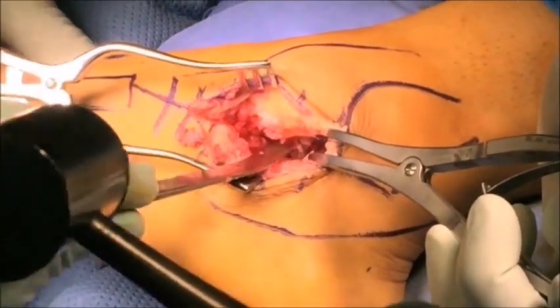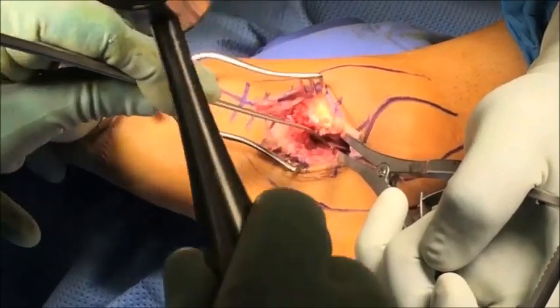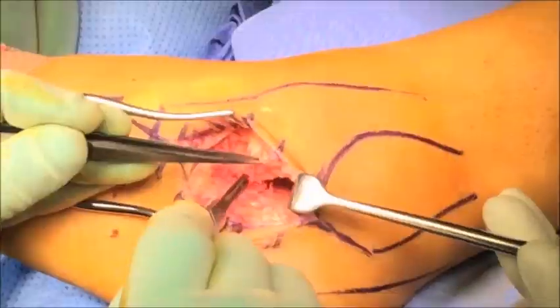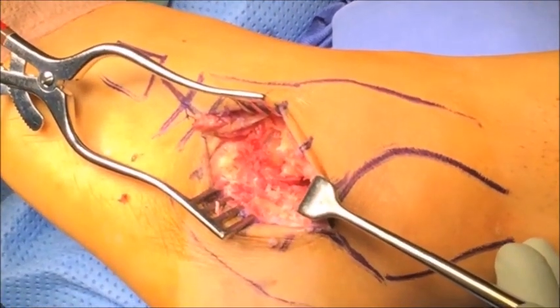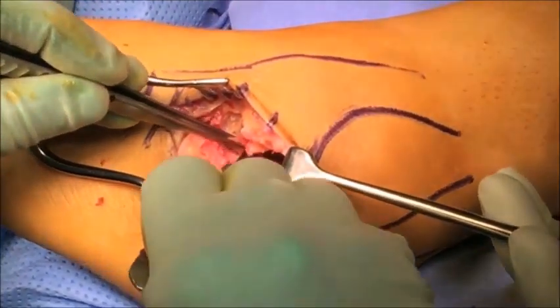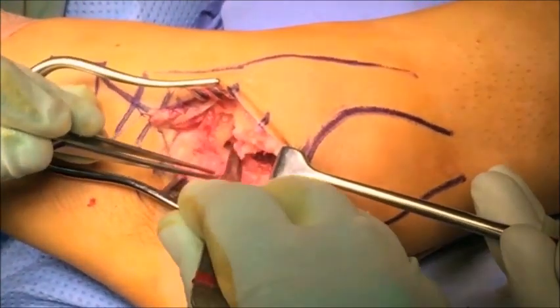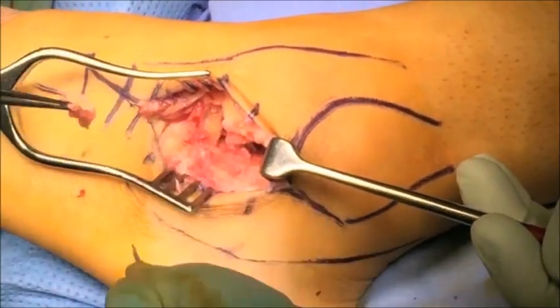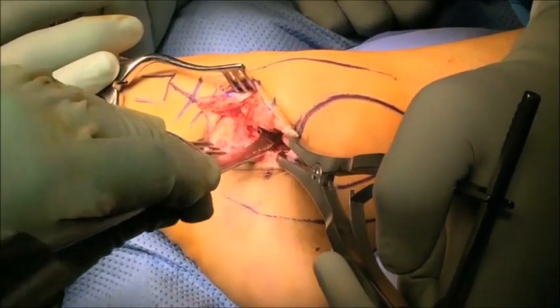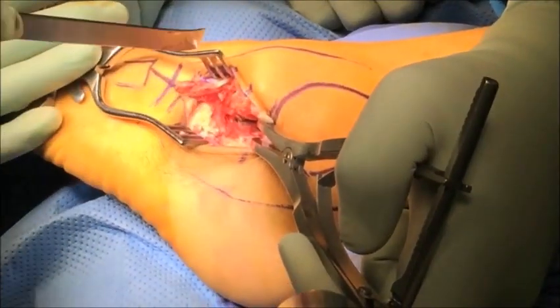The anterior half of the joint is now prepared in the same manner with osteotomes and curettes. At this stage we've only really addressed the posterior facet. To visualize the middle and anterior facets, the sinus tarsi area has to be debrided — the soft tissue is carefully removed using sharp dissection. Once the middle and anterior facets become visible, they can be prepared in a similar fashion using sharp osteotomes and curettes.